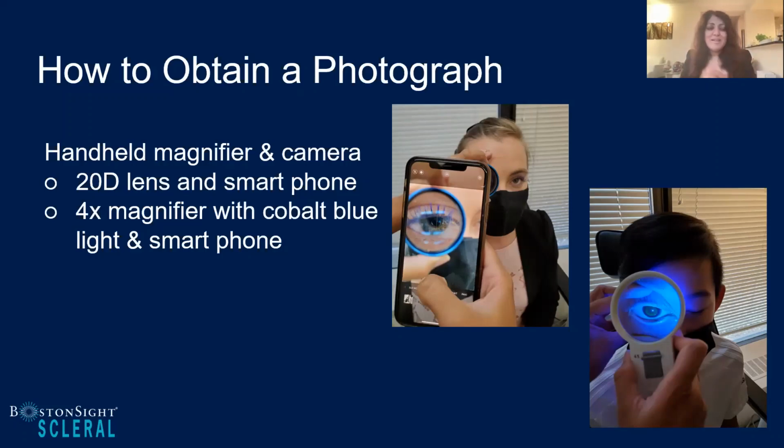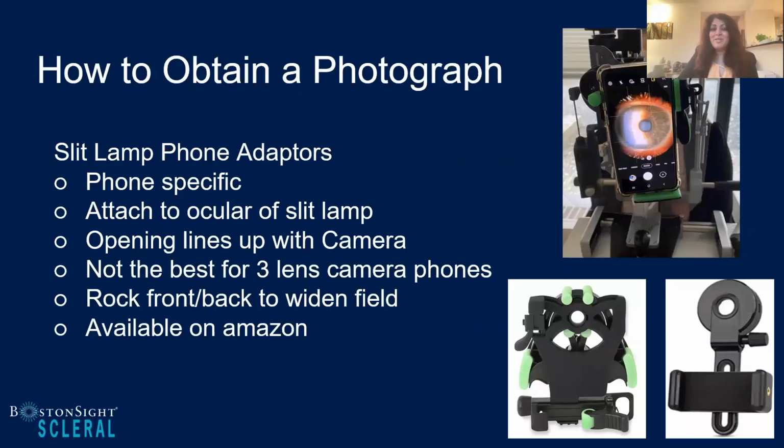Also use your tapping to get things into focus and then hold it in place. It's a little bit tough. And I think Avani has some better ways to use the slit lamp on a smartphone. So I've tried your technique, Shalu, and for me, with my shaky hands, it just doesn't work. I'm surprised I can still hold a 90 in my hand without moving, but you end up with 50 photos and you only end up using 1 or 2.